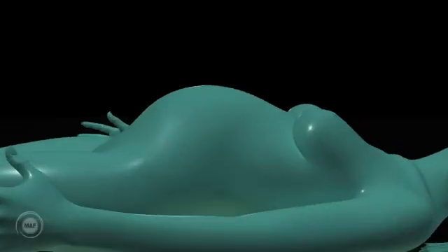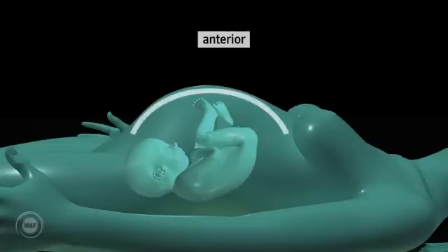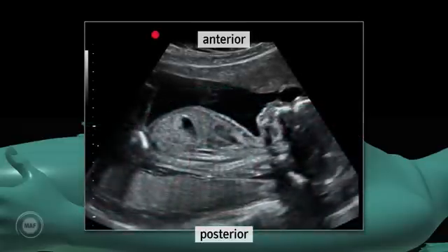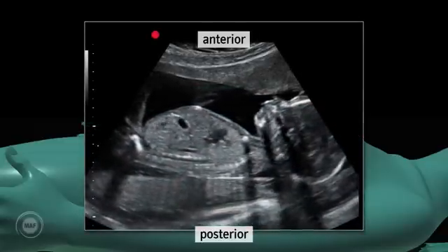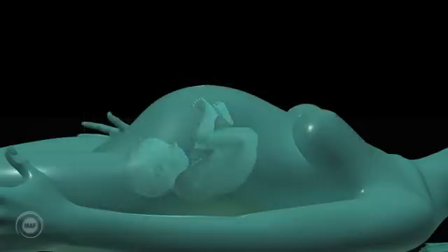Anterior and posterior. If we're considering the anteverted uterus and are scanning in both the longitudinal and transverse planes, then the anterior part of the uterus is the front of the uterus, nearest the mother's belly button, and the posterior is the back of the uterus, nearest the mother's spine. As an image on the monitor, the anterior part is represented uppermost on the screen and the posterior part on the lower part of the screen.